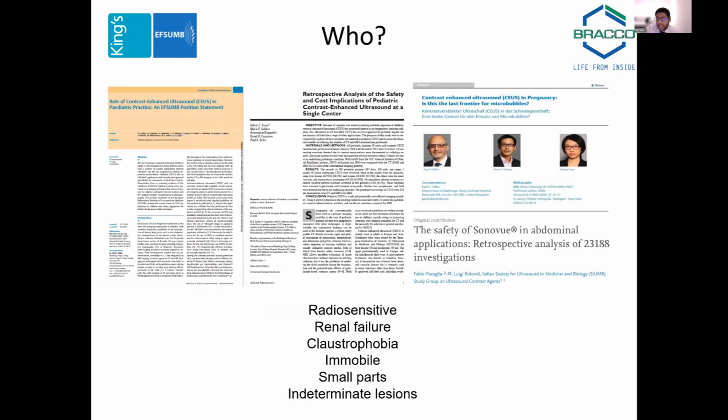So who can have it? Well, the truth is almost anybody. We know that it's been shown to be safe in pediatric patients from our study, from the EFSUMB statements, but also it's been increasingly recognized that the contrast ultrasound agent does not cross the placenta and therefore is thought to be safe in pregnancy. And the larger scale studies have shown it's safe in almost everybody else.